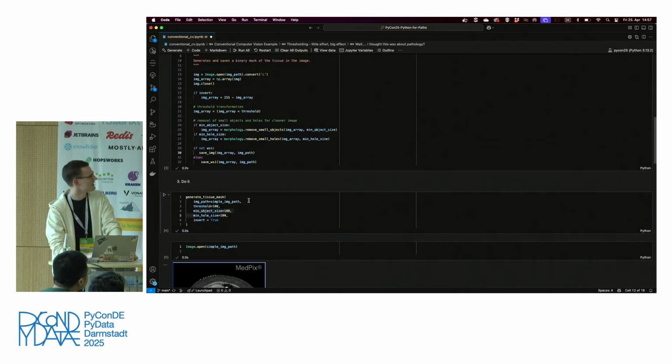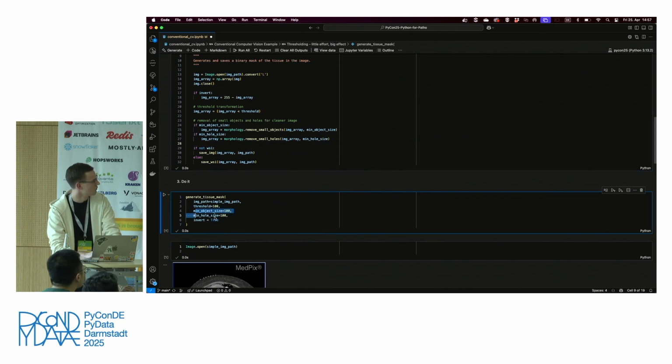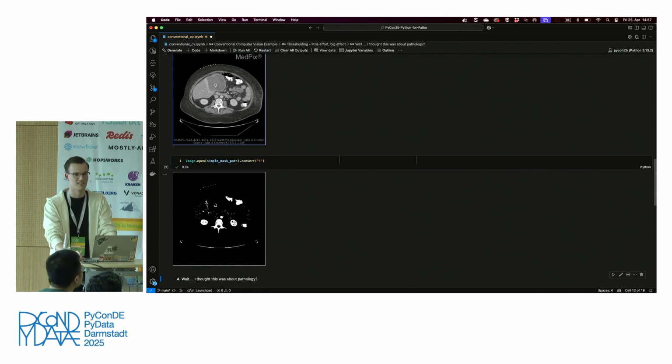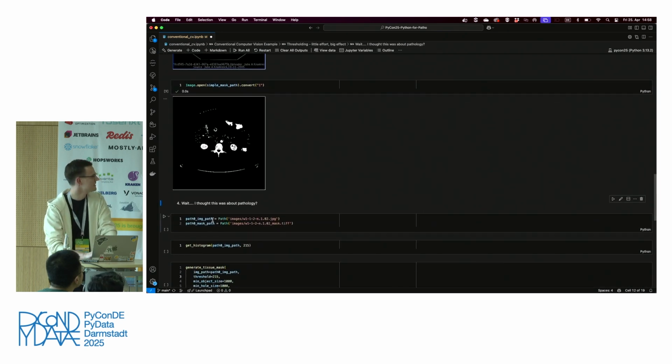And maybe a little thing, we also included these morphological operations here, which are basically just there to make our image prettier. We can, of course, simply remove them without any problem. It looks like a mess. And even with such simple things, we can already increase the quality of our image by quite a lot without even touching machine learning in the slightest.